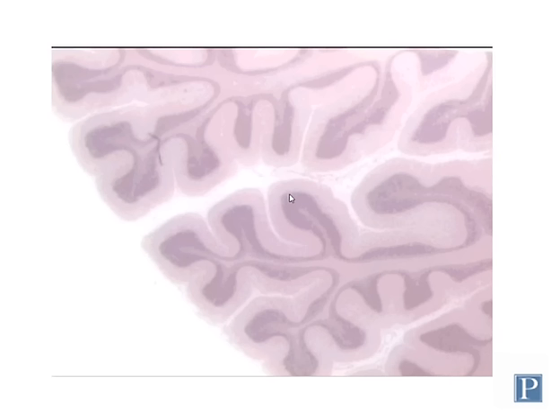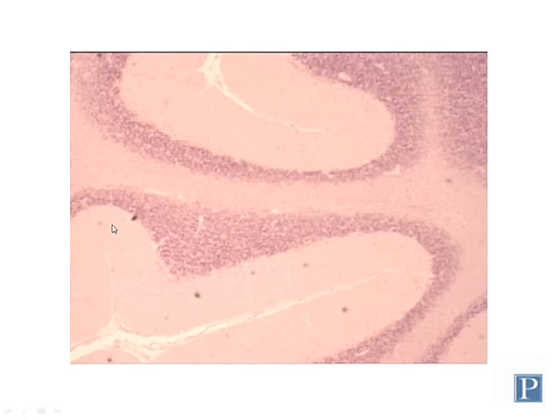In the cerebral cortex, there are actually 6 layers, but you cannot easily distinguish those using a simple H&E stain. But in the cerebellum, you can distinguish those layers. So let's take a closer look with a higher magnification view at what the cerebellar cortex looks like when it's magnified. So here's a higher magnification view.